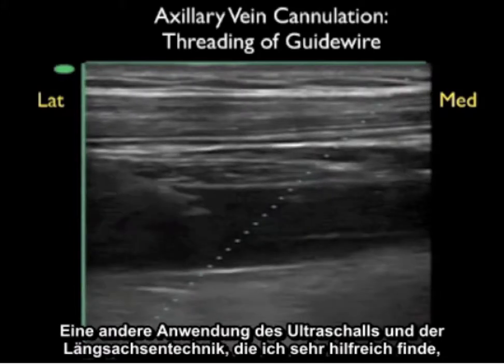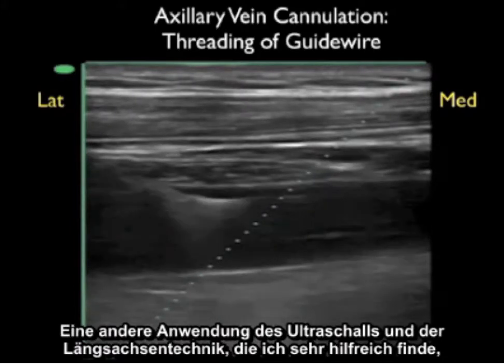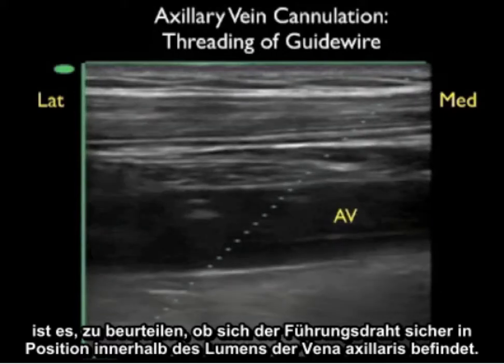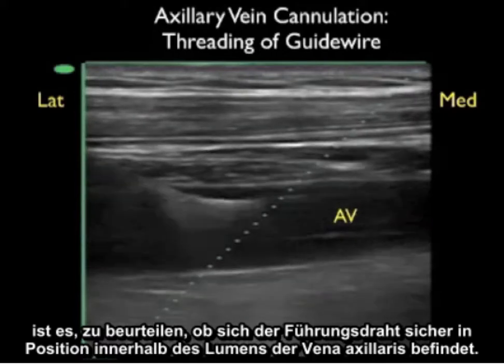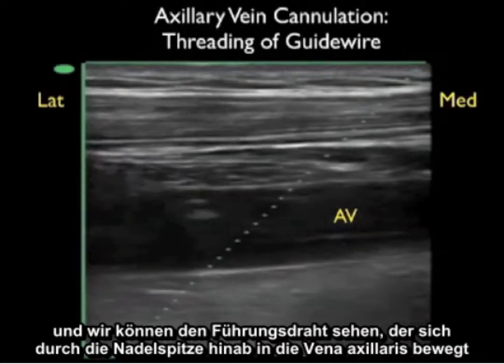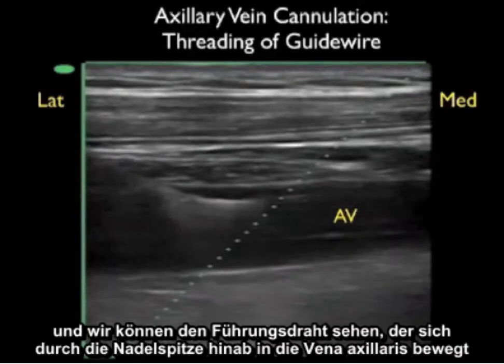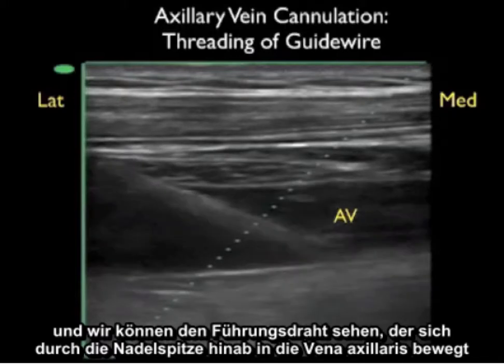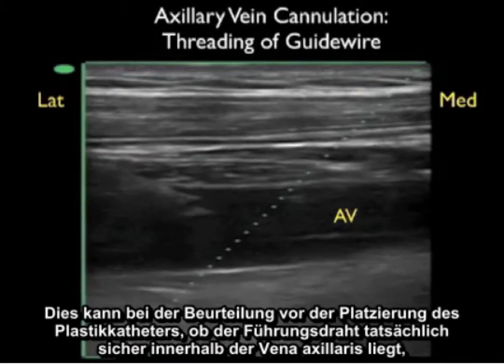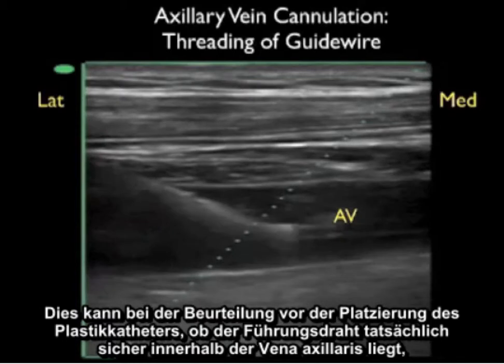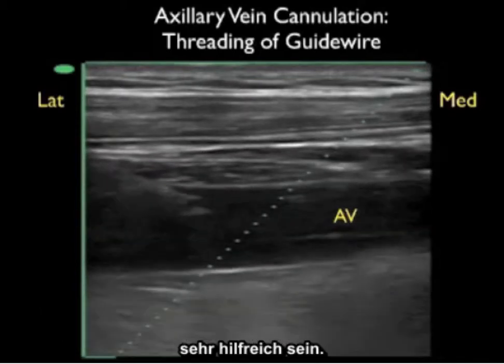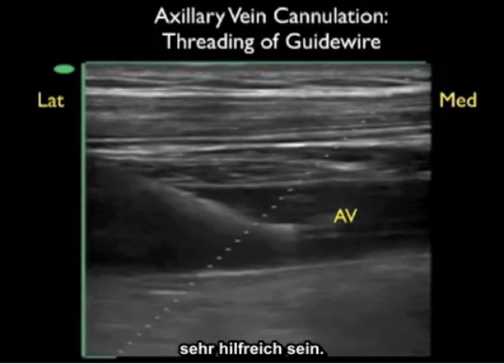Another very helpful use of ultrasound in long axis technique is to confirm that the guide wire is safely positioned within the lumen of the axillary vein. We can see the needle coming down from left to right and the guide wire passing through the needle tip, moving down the axillary vein toward the superior vena cava. This is very helpful in verifying that the guide wire is safely within the axillary vein prior to placement of the plastic catheter.